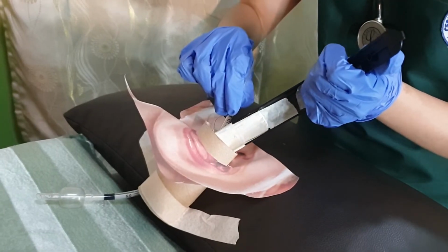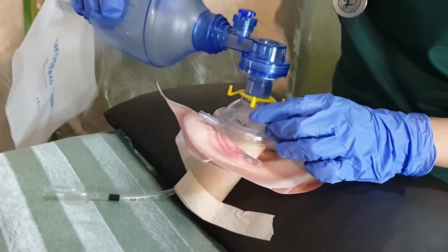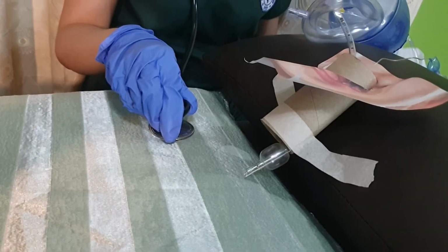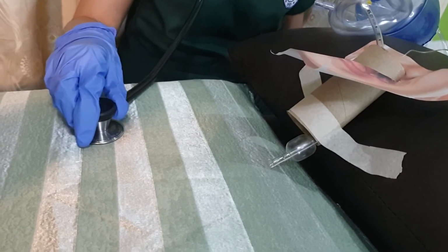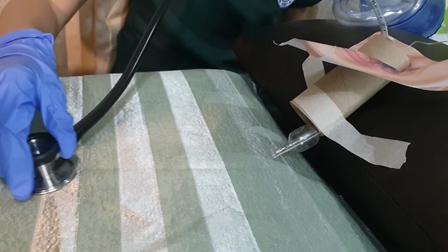Remove the laryngoscope, then remove the stylet and connect the endotracheal tube to the breathing circuit. Check by auscultation of the lungs for equal breath sounds. If there is equal breath sound, secure the tube in place by using the plaster.